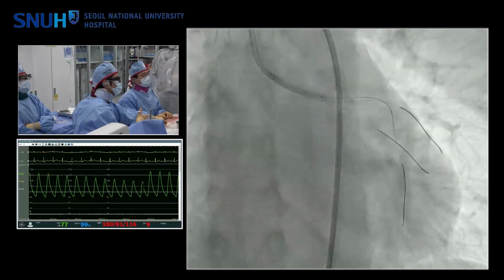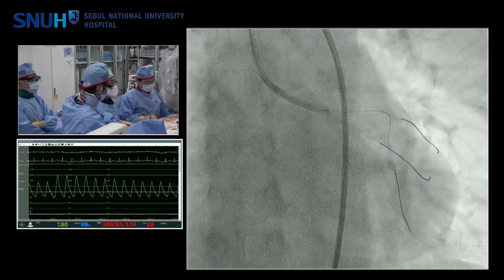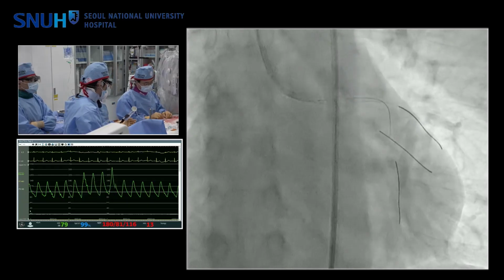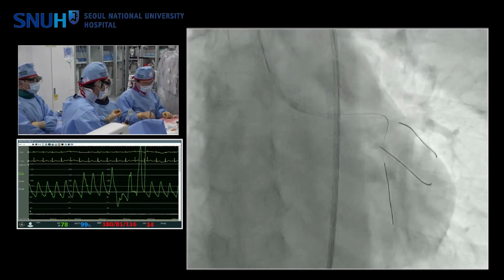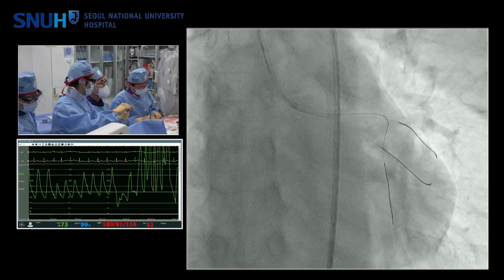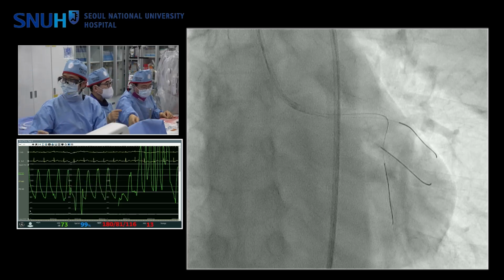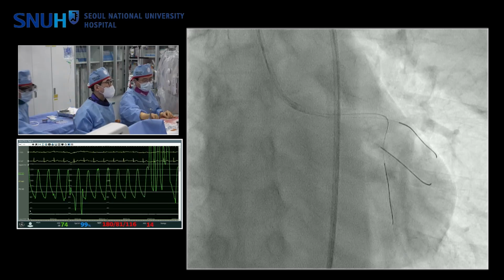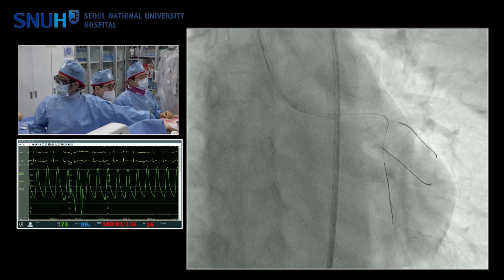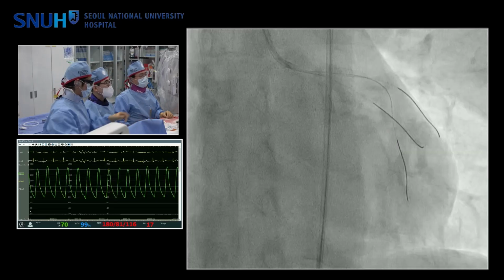So HS Kim, do you do the pre-dilation or just put a stent? We did pre-dilation with a 2.5 balloon, and we implanted Zion's stent 2.75 by 23, and we withdrew the stent balloon and performed a POT only to the left main with 20 atmospheres, the highest pressure permitted in this balloon.